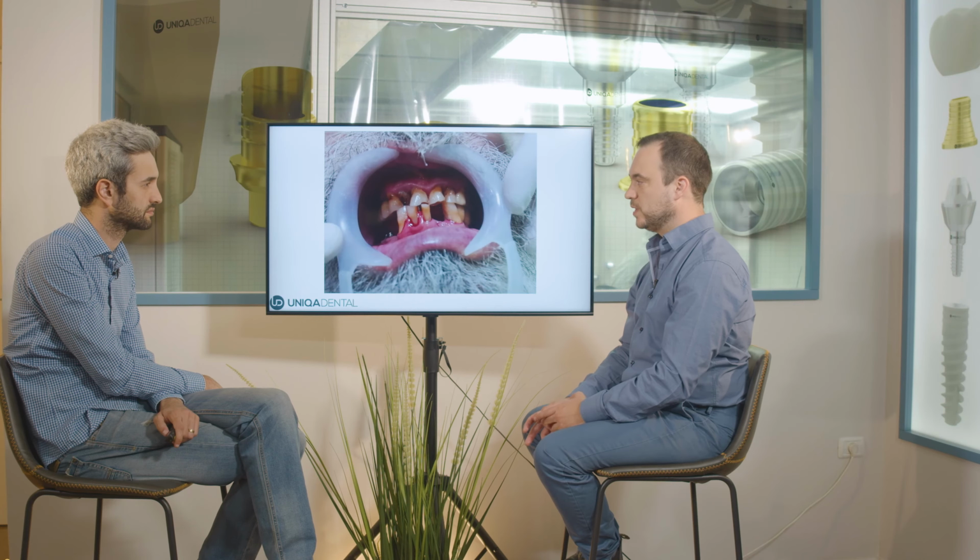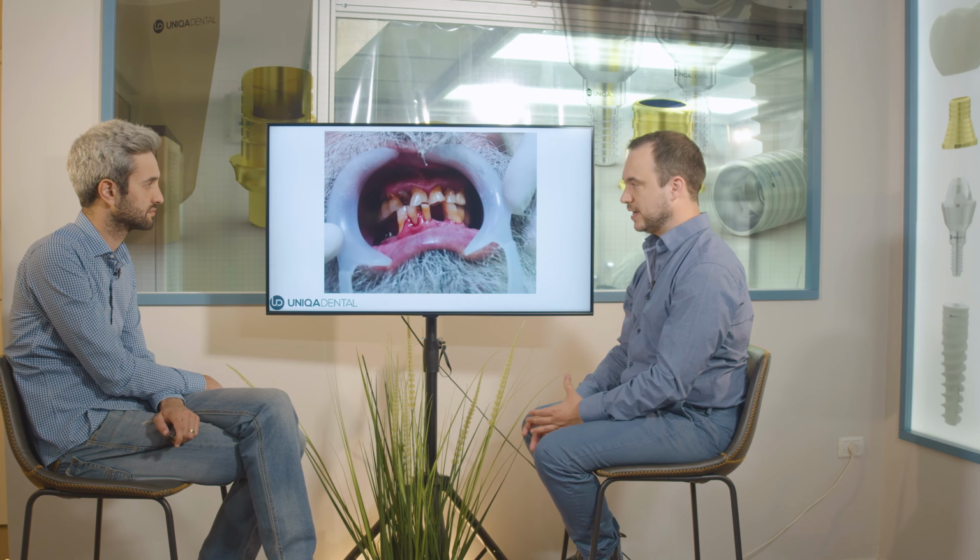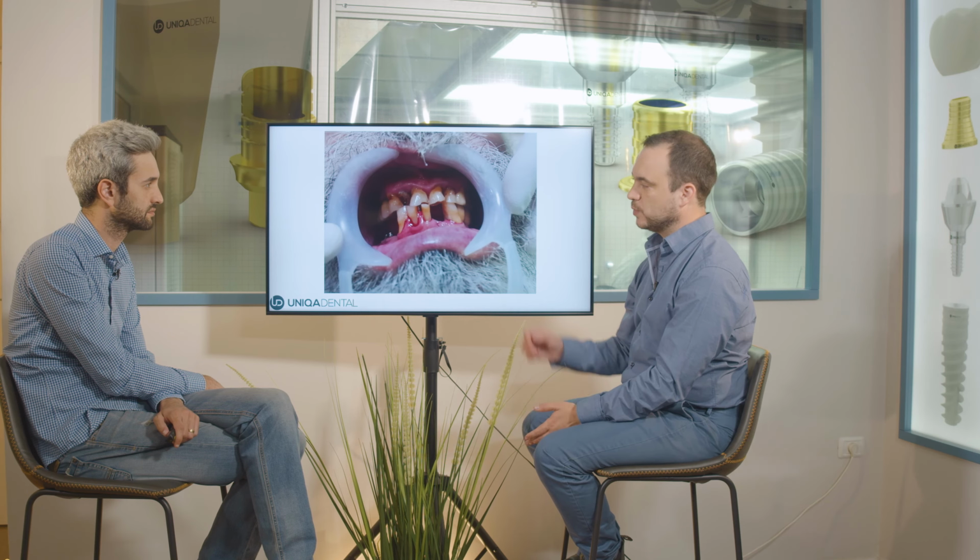Now we need to take impressions on the implants with the teeth. Later on, we'll need to make some kind of bridge on those teeth and on those implants and extract the problematic teeth. So we had transfers on both sides. You'll see the left side also. Those are transfers on the right side.